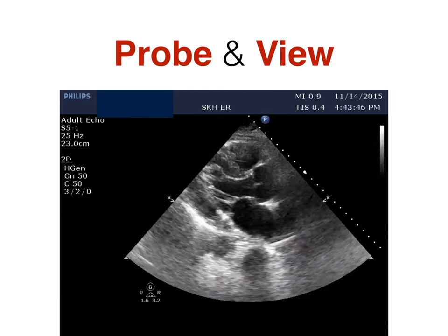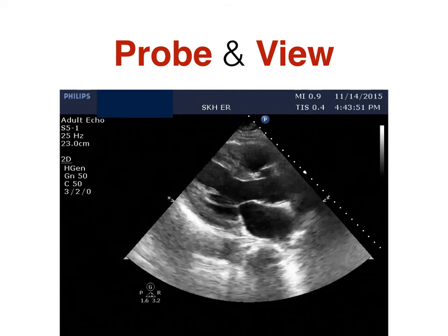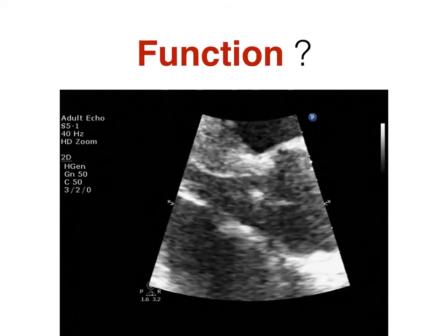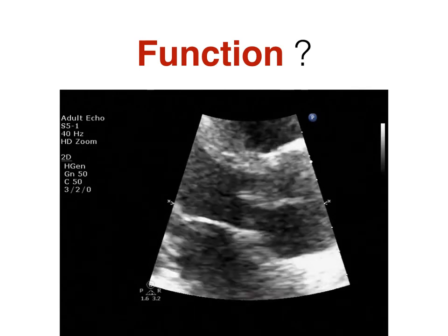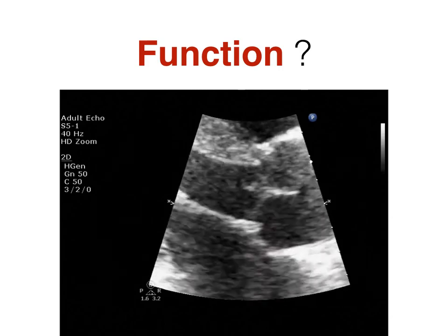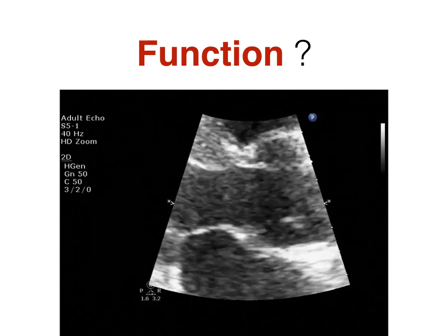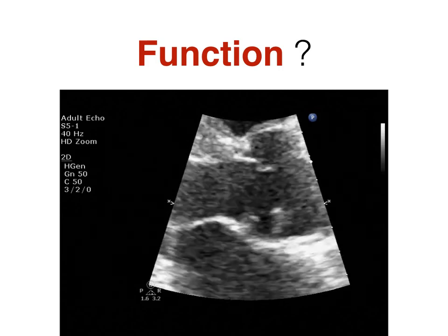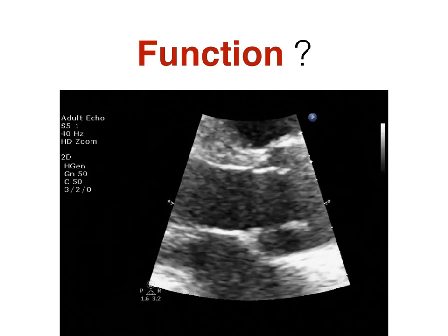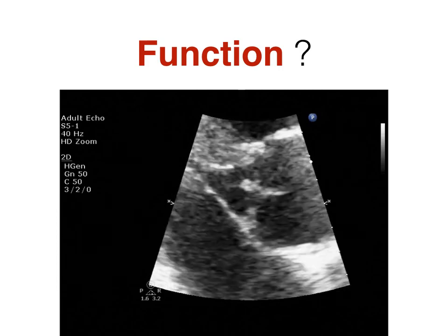And the heart probe, right? What is this view? Parasternal long axis, right? So what is this function? Zoom, right? To amplify this regional area, just like if you are trying to measure the LVOT, or if you are trying to see a valve problem, these patients, we have to incorporate into the patient's clinical presentation.